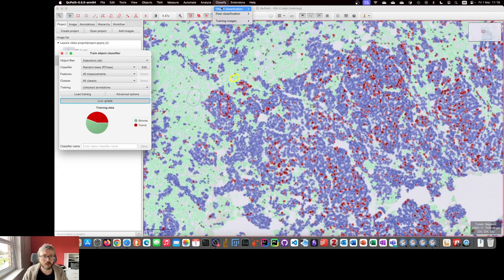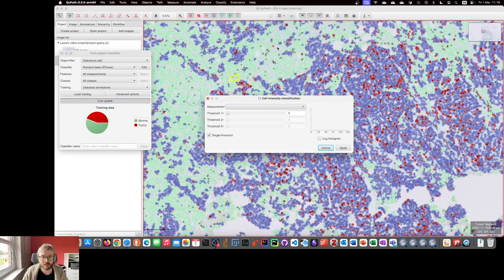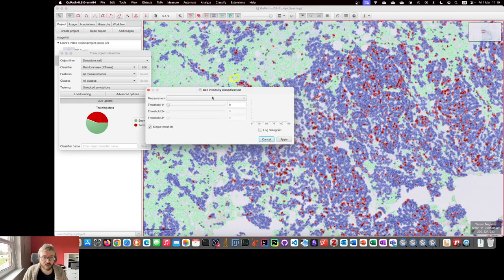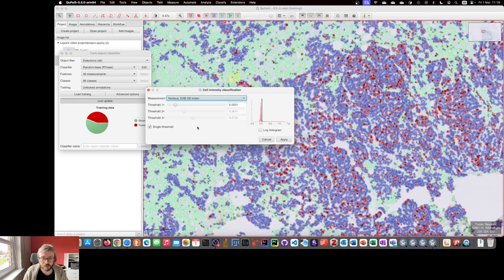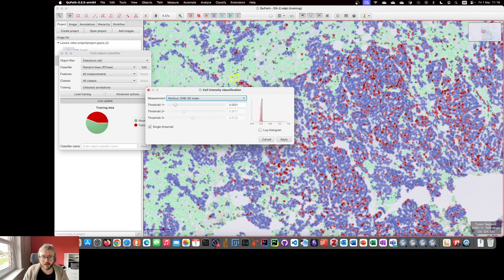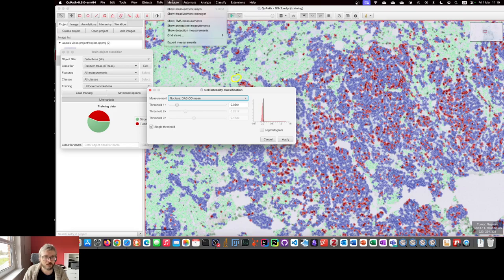But if I go to object classification, set intensity classifications, and I want to classify by the DAB mean, then I can't interact with the image, zoom, press any other buttons, run any other commands, or at least can I?